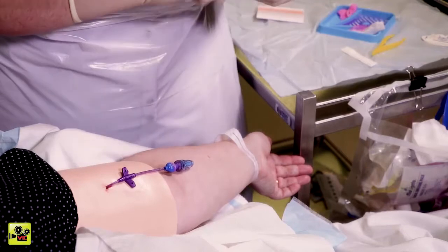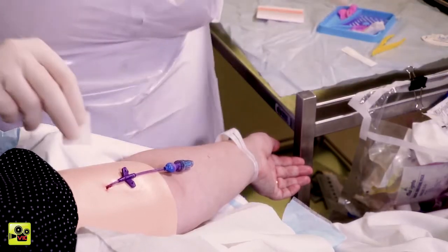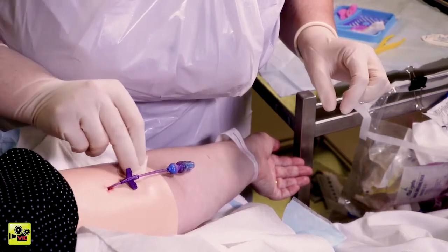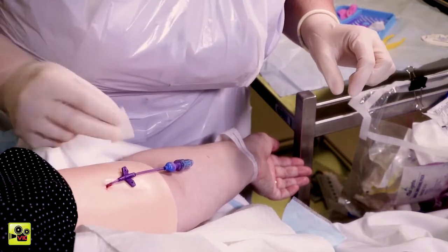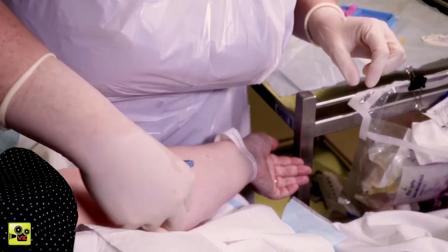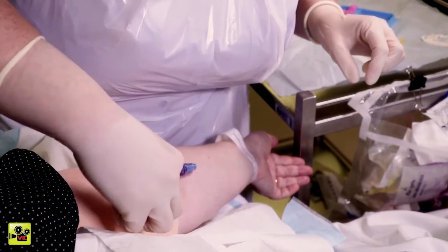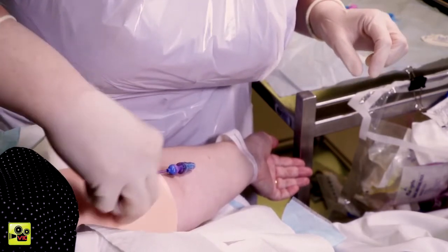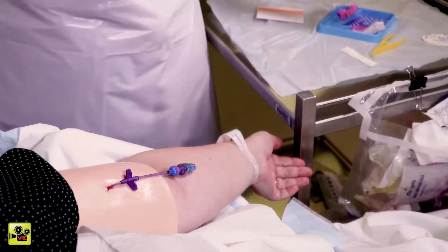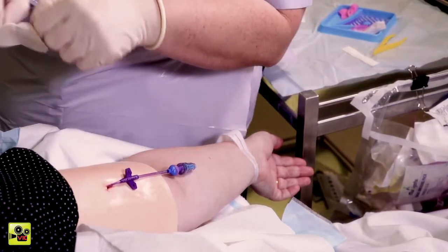Alrighty, I'm just going to put a skin protectant pad on there for you. This just keeps your skin nice and stops it from getting irritated from all the sticky that goes on it. I can be a bit allergic to plaster and adhesive sometimes. But you've had no troubles with this one? Not so far. That's excellent. Let us know if anything does happen.